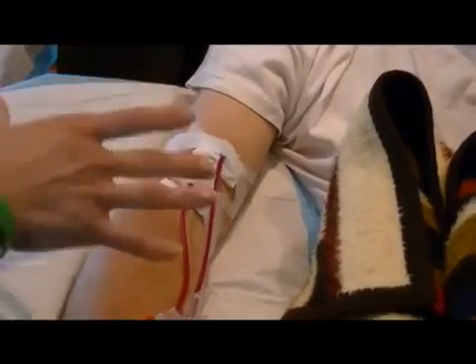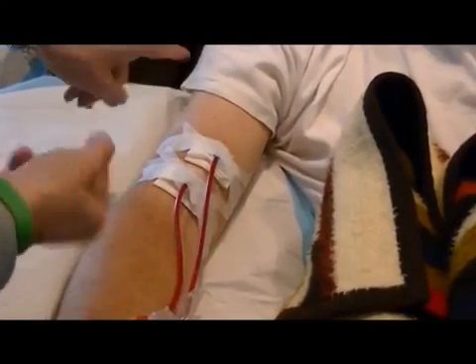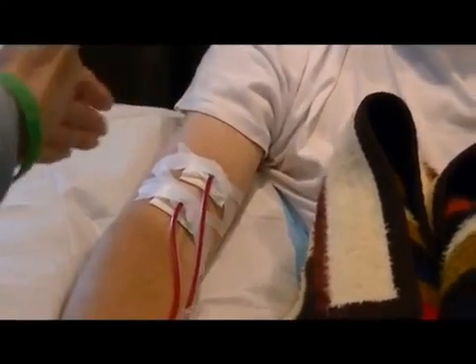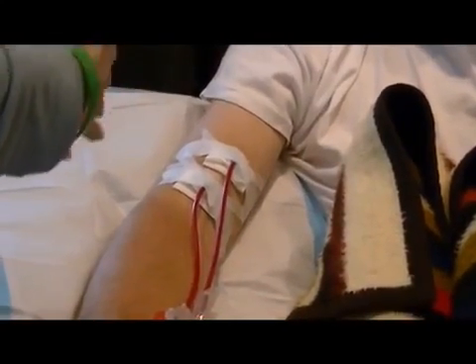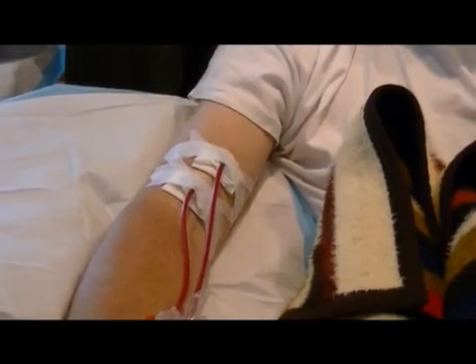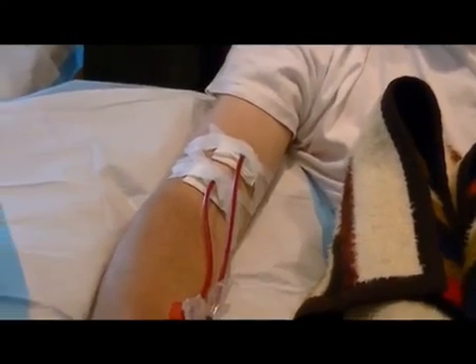So now he has his fistula, and we stick both of those. Another good thing about the fistula is that you can run at a higher speed than with the catheter in the chest. You can't run as high with the catheter, so it takes longer whenever you're using it.